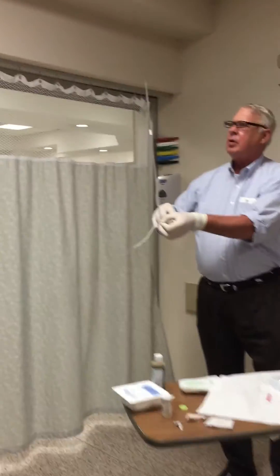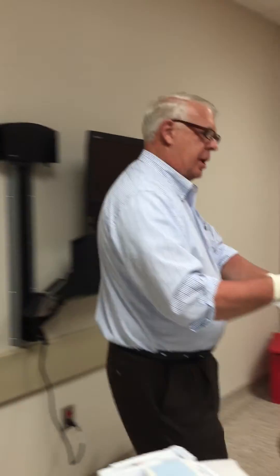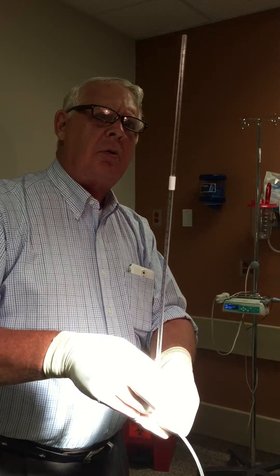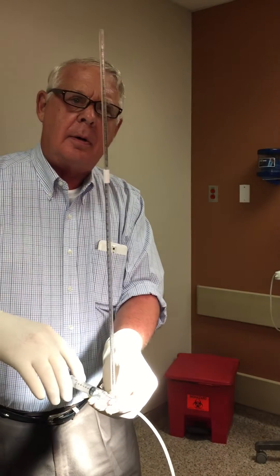Can we maybe turn on that light over there? Because I've got to see the column. It's got to be on the manometer. There you go. Okay, good. There's where we're going to be able to locate that. That's straight through — and this fills our column. Okay, all right, that's straight through now.